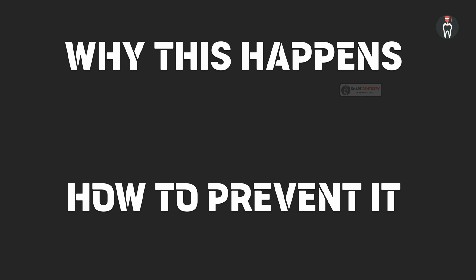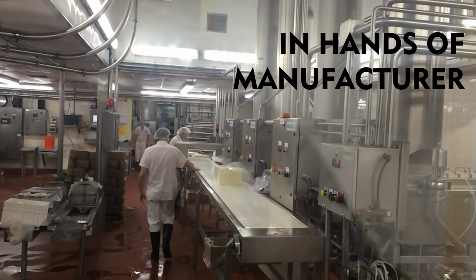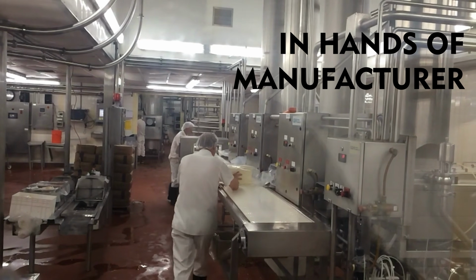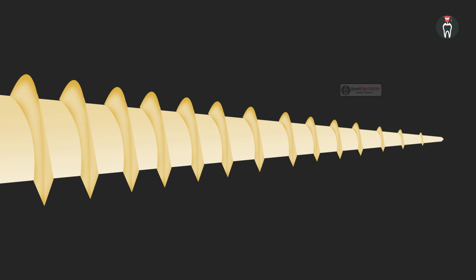Let's see in detail why this screw-in happens while doing cleaning and shaping and how to prevent it. There are two factors we have to consider. One, the factors which are in the hands of the manufacturer of the file, and then the factors which can be influenced by the dental practitioner. First, let's see the factors which are controlled by the file selection or by the manufacturer. First, choosing a file with a non-cutting tip will minimize screw-in effect inside the root canal system.